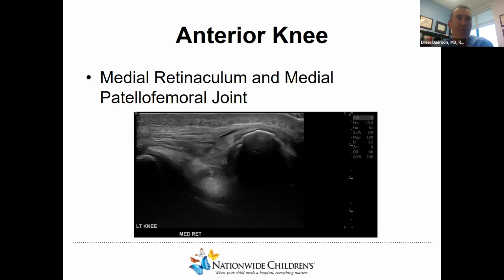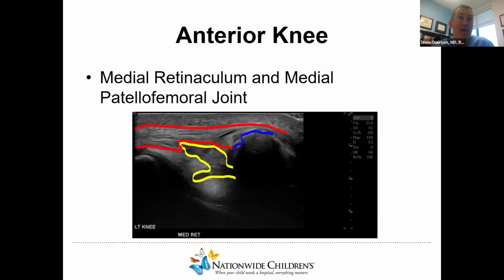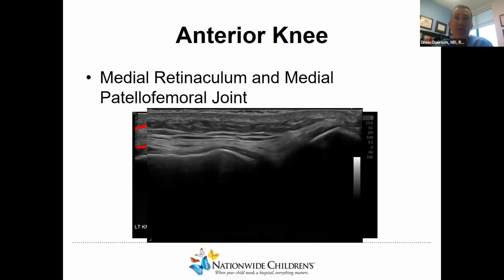And this is the image of the patellofemoral joint and the overlying retinaculum. Admittedly, it was even difficult for me to draw these accurate lines over this very abnormal appearing retinaculum. It was thickened, heterogeneous, and had some discontinuity to it. Deep, again, we see in yellow there our medial recess with some fluid distension, no obvious loose bodies yet. And if we compare that to the normal side, we can see a big difference.